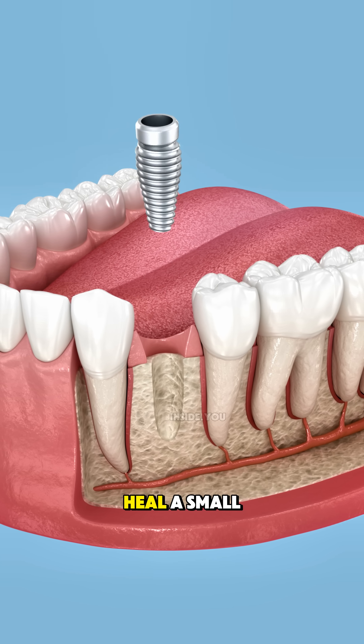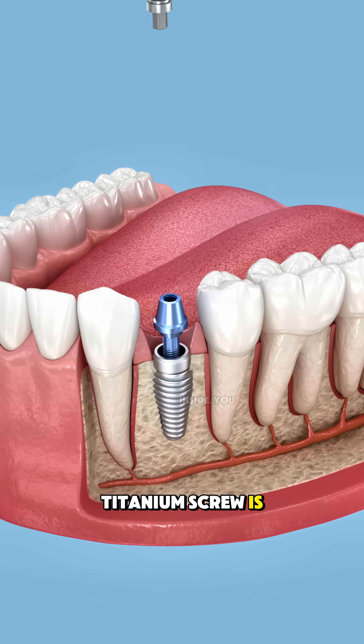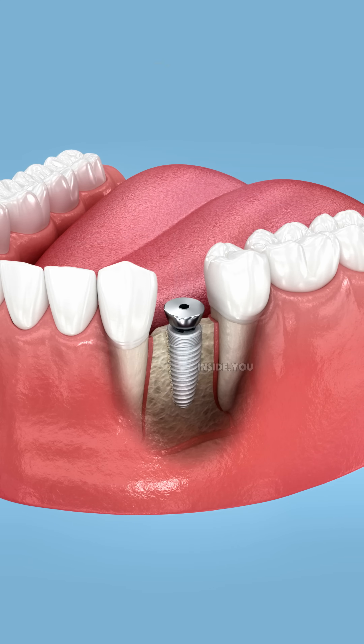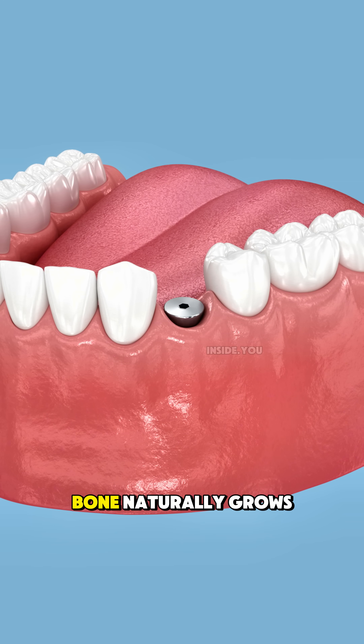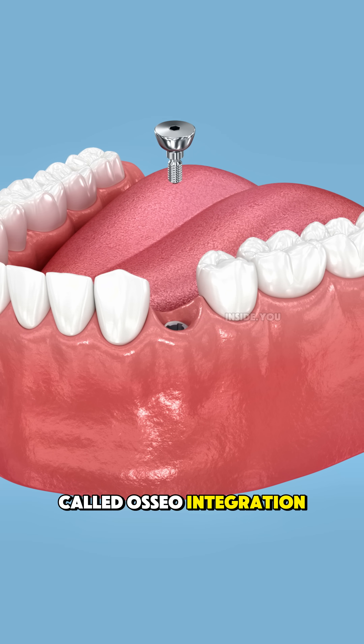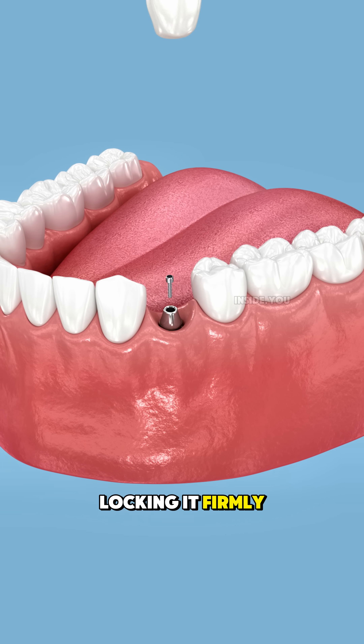Once the gums heal, a small titanium screw is placed into the jawbone, acting as an artificial root. Over the next few months, the bone naturally grows around it in a process called osseointegration, locking it firmly in place.